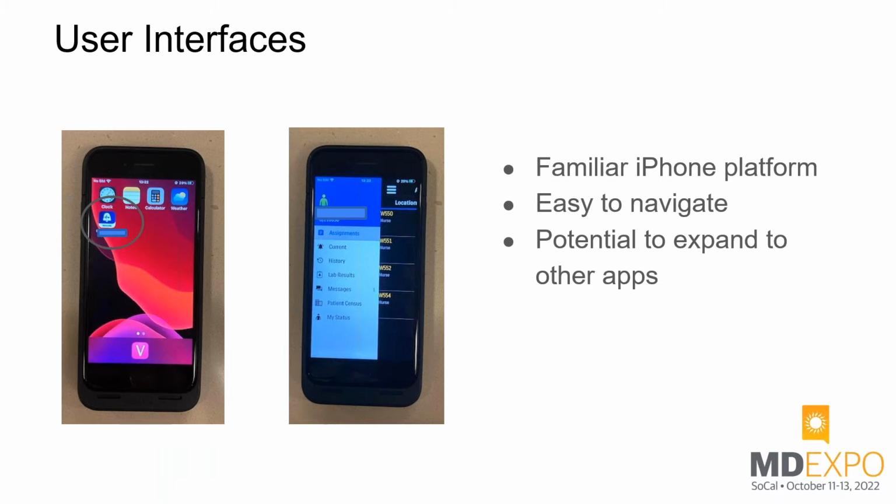I've got one question. Yeah. Do you have different sets of alarms for your codes? If your code is in an ICU, the code card might not be there, but if it's in a general care unit, the movement has to be announced over the PA. Do you have different sets of rules that you set to do that? Yeah, for the coding, yes.